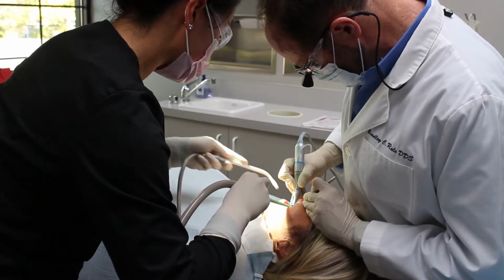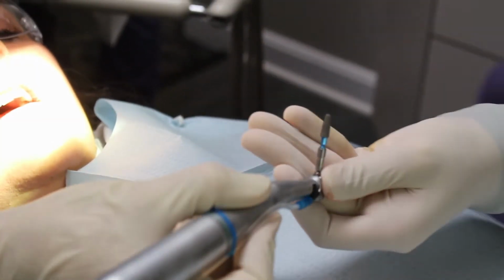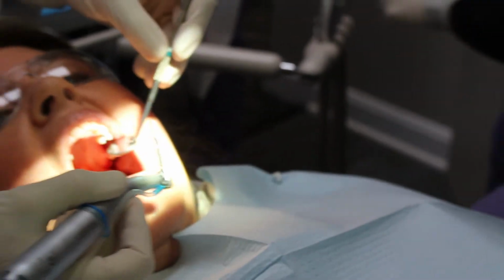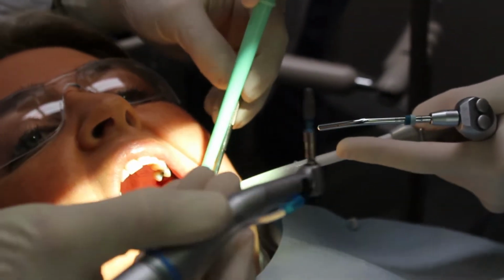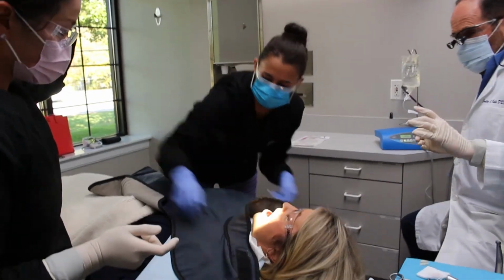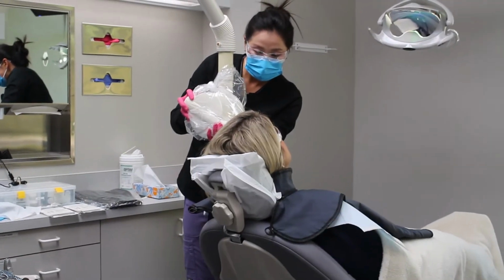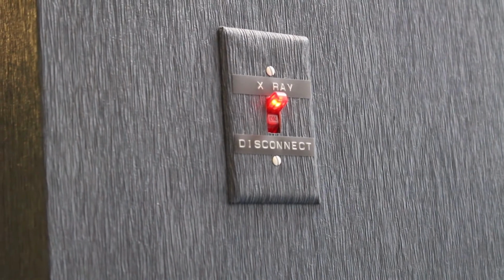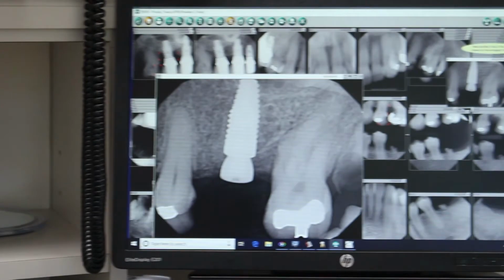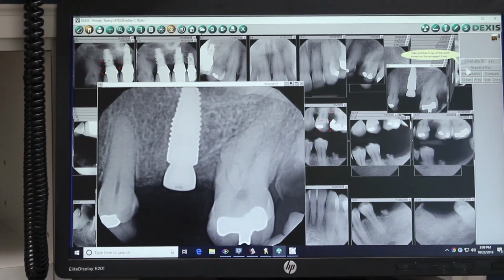We typically then slowly put the implant in and then go to the crest or the height of the bone. That's our 12mm implant. And there we take another X-ray to make sure the implant is seated properly and in the position we are desirous to achieve. With a dental implant, there's no need to take it out. When it goes in, it is in. And it, in essence, replicates the root of the tooth.